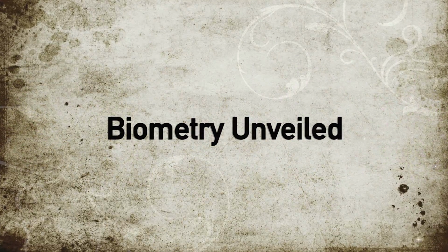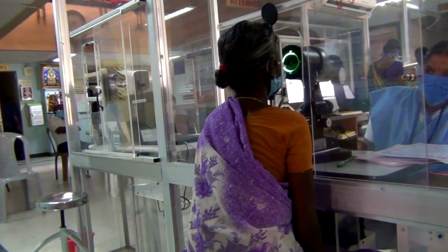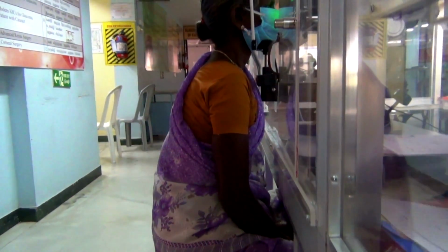Biometry is an art and it requires methodical planning and implementation. So here we have made an ophthalmic cubicle which harbors all the instruments required for patient evaluation during this COVID era without compromising the patient as well as the healthcare workers' safety. The first step would be proper patient positioning. Proper back and head position with comfortable seating is required for flawless analysis, and we have been able to achieve that in this cubicle.